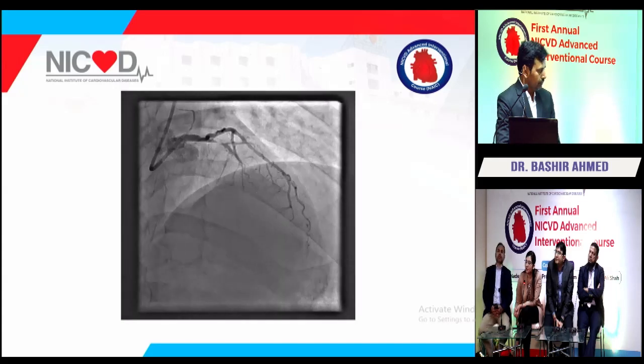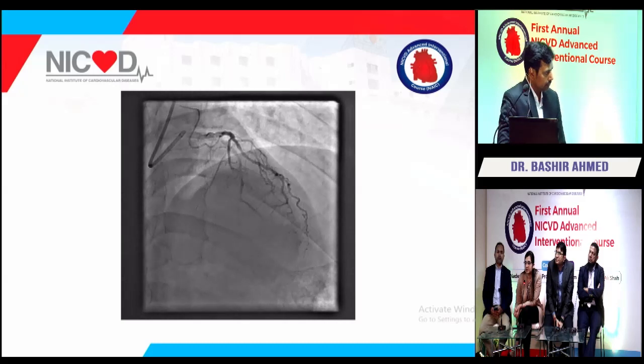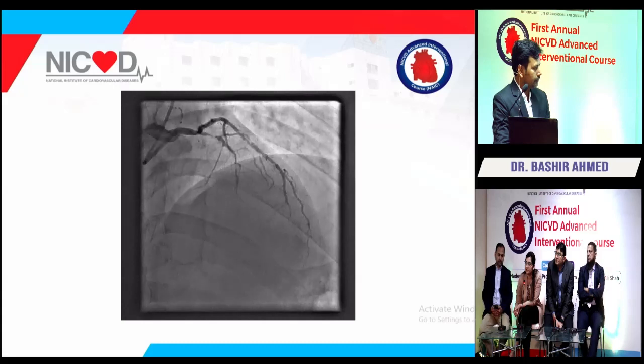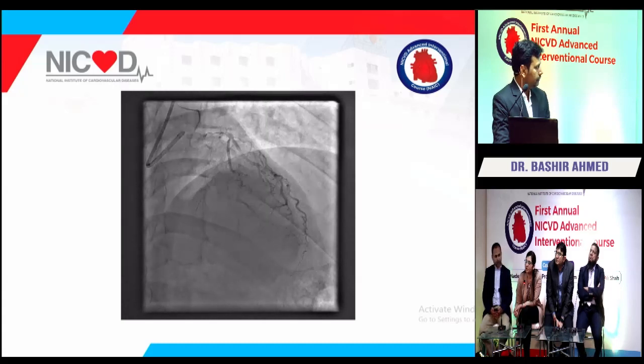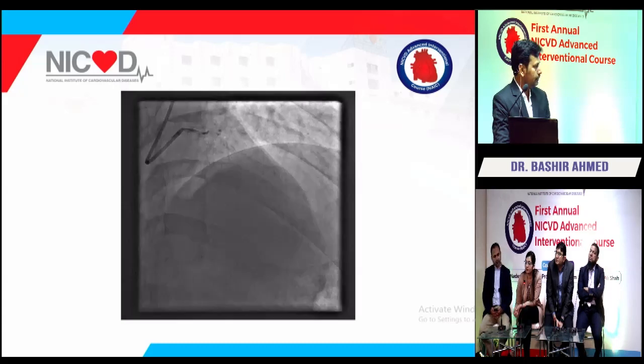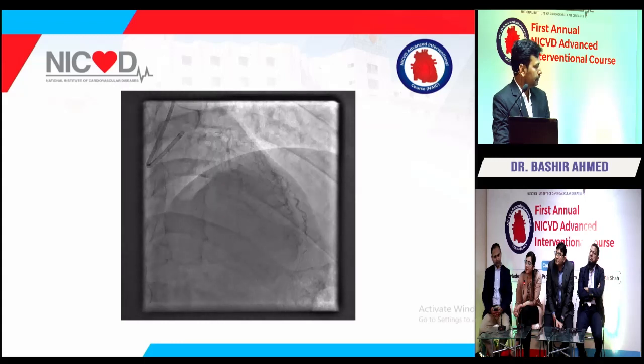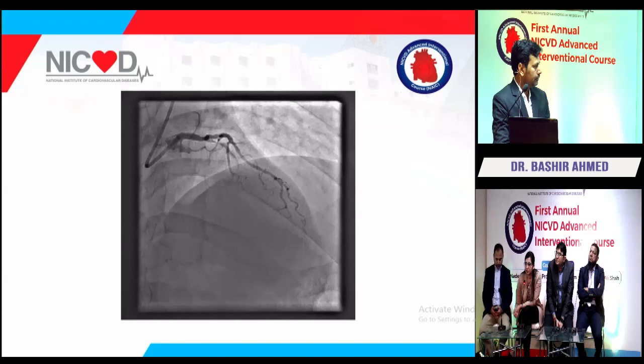Now we do have multiple options available. First, I'm sure an NC balloon did not cross this lesion. There are other specialized balloons also. Of course, there's a problem with passing it down into the LAD. So we could think of atherectomy options.